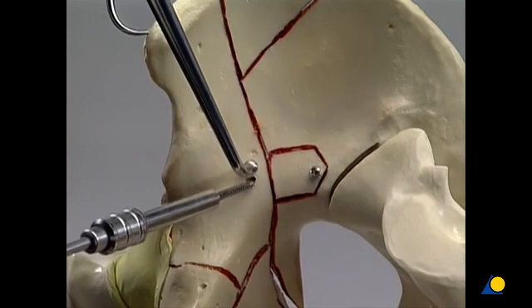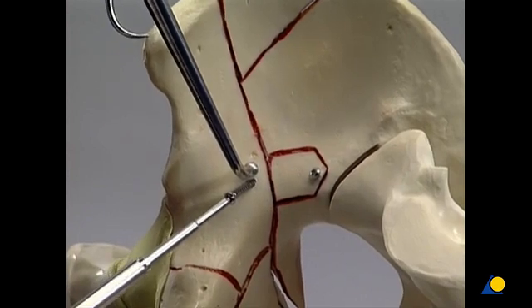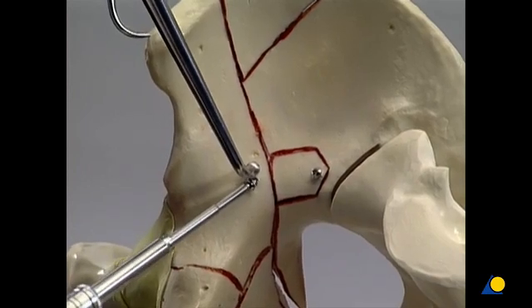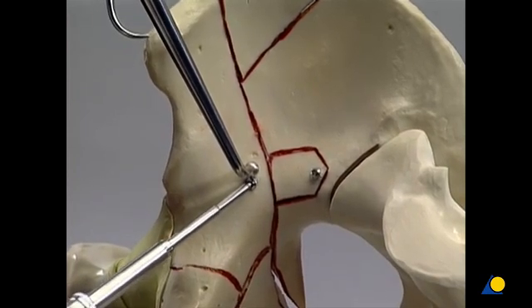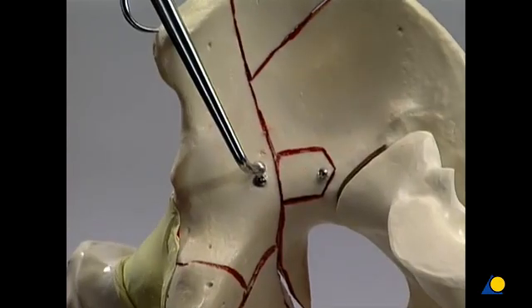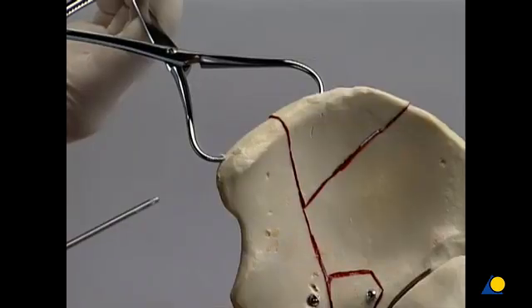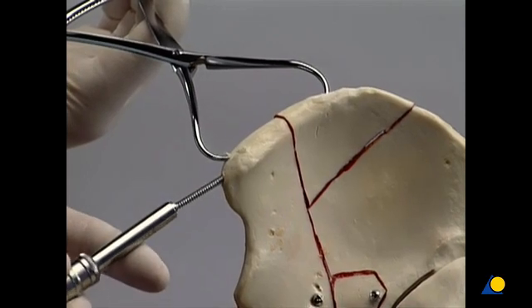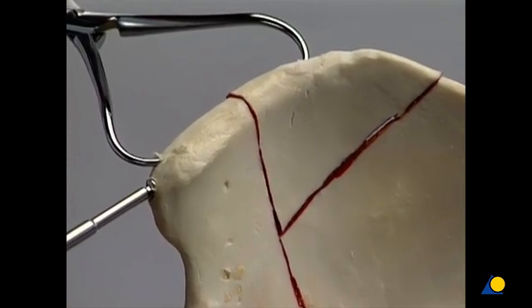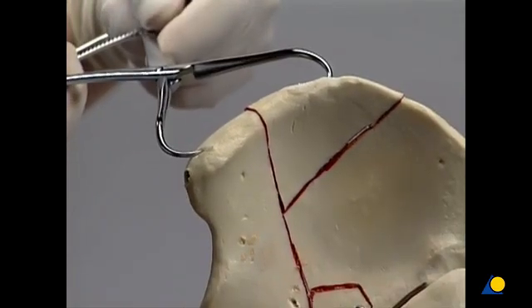In the next step, a short lag screw is inserted from the inner aspect of the fossa to the outer iliac wing fragment, crossing the oblique fracture line. The pelvic reduction forceps is removed. A lag screw is now inserted across the iliac crest, and the reduction forceps is removed.